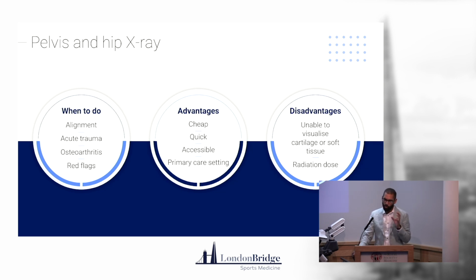You've got to say query right hip injury, right hip fracture, and not just pelvis, because otherwise you won't get the right views and the right alignments from that point of view.